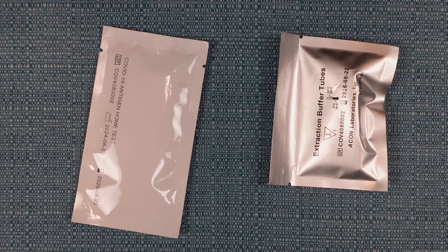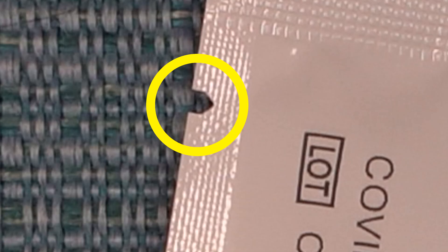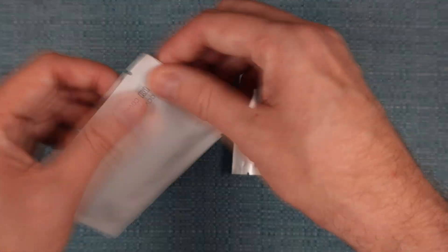You'll see two pouches that have little slits on them that you can use to tear them open. Go ahead and open both of those.